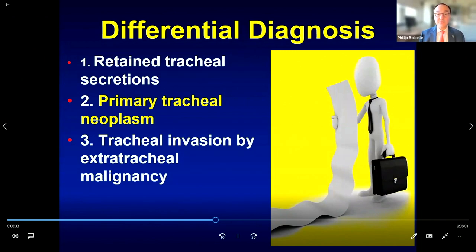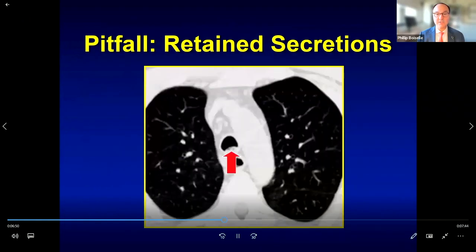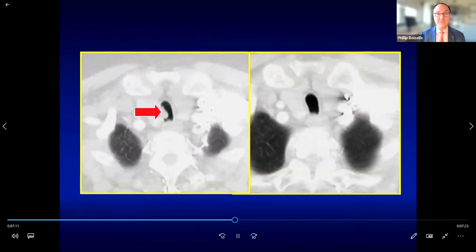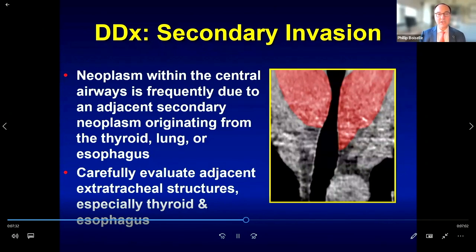Also consider tracheal invasion by an extratracheal malignancy, but here we saw no enlarged masses from the esophagus, thyroid, or lungs. Another consideration is retained tracheal secretions, which typically appear as dependent opacities with gas bubbles, but can adhere to non-dependent areas. In those cases, limited repeat imaging after coughing can help — as shown here, a polypoid lesion that disappeared completely after a coughing maneuver. Always look carefully at adjacent structures when you see focal tracheal wall thickening or an intraluminal mass.